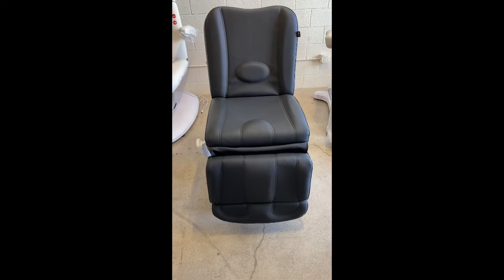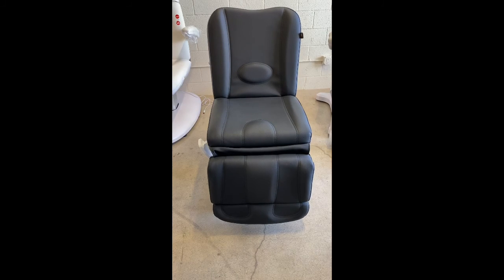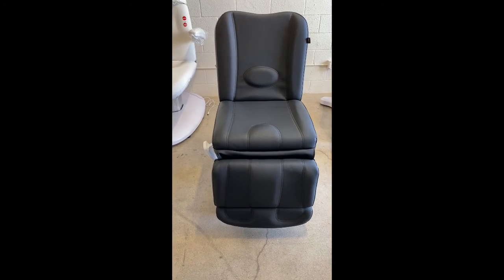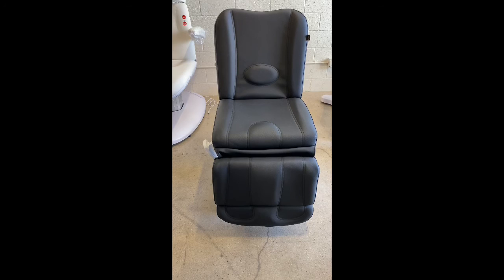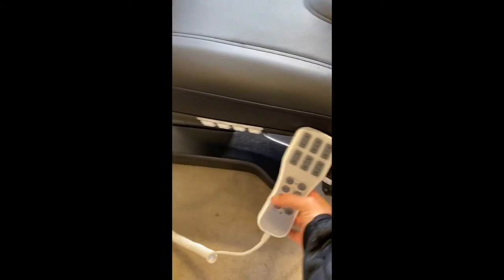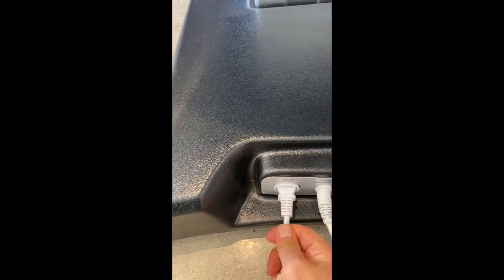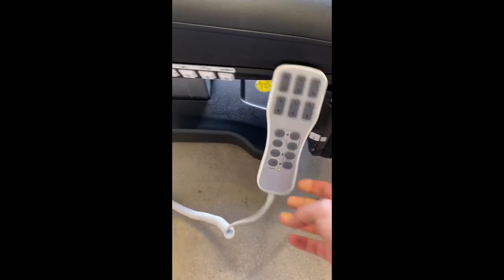Hello, today we'll be showing you how to troubleshoot the power on the Palermo treatment table if none of the functions are operating. It could be a couple of causes. First, you want to try to operate it with the hand remote control, and you want to make sure that the cable is connected all the way in, and the power cable as well.